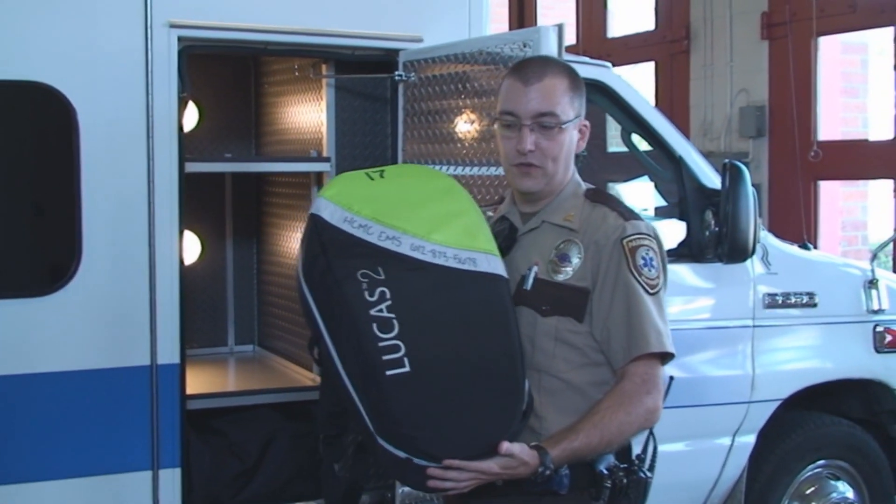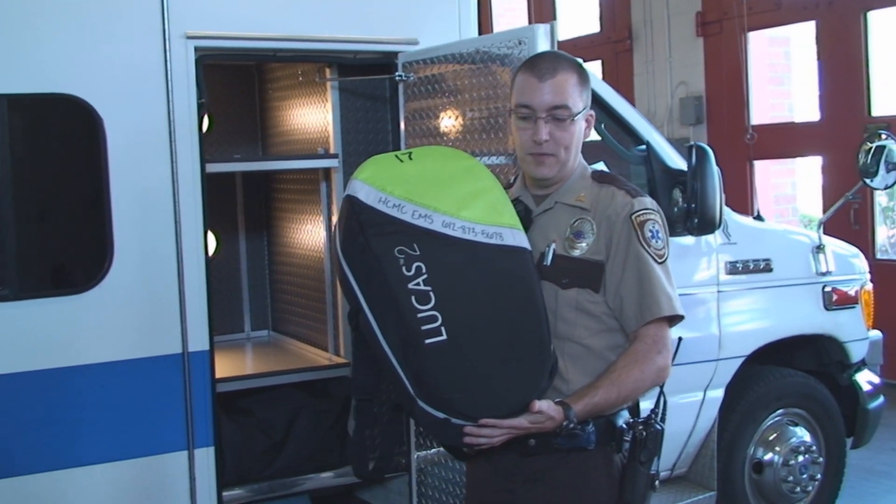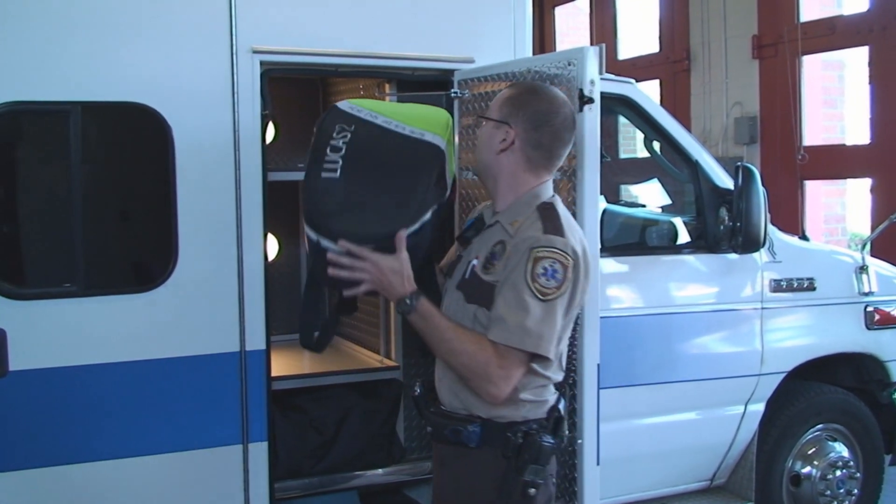This is the Lucas 2 device. This is used for CPR. Everyone out there should know their CPR. This assists us in doing proper CPR.